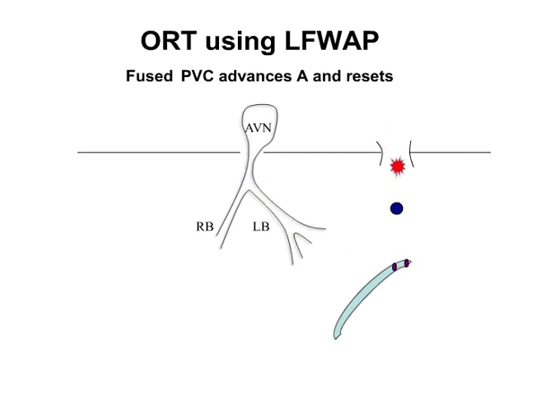You may get through, it may not be refractory, but if you can get through the pathway, advancing the A, and then you show that the tachycardia is permanently reset, so the next beat comes equivalent to how far you advanced the A, then you've also proved that it's probably part of the circuit.